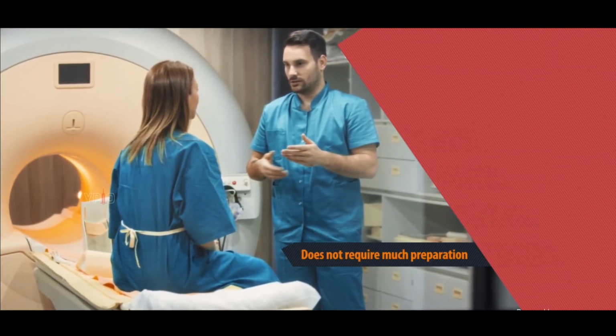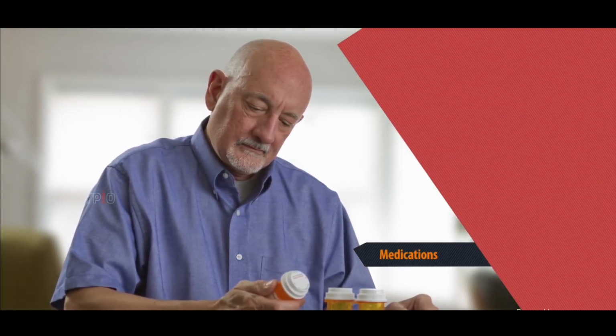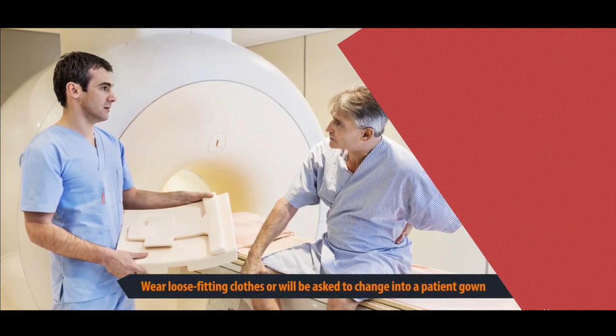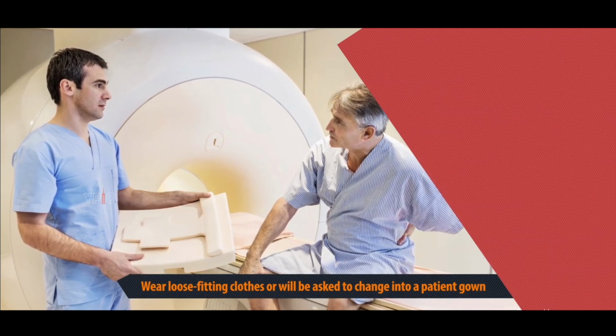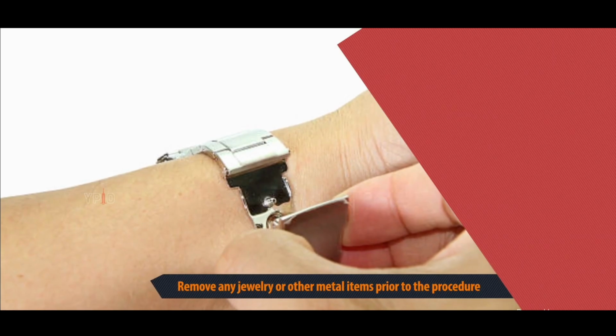Magnetic resonance imaging does not require much preparation. You can continue your ongoing medications unless instructed otherwise by your doctor. You are required to wear loose-fitting clothes or will be asked to change into a patient gown. Remove any jewelry or other metal items prior to the procedure.